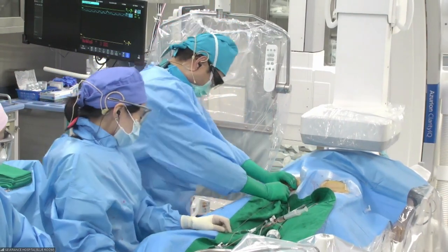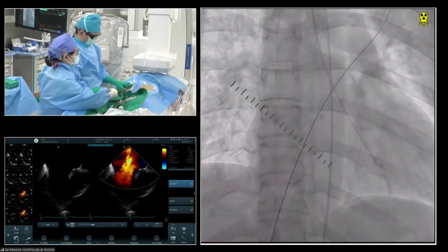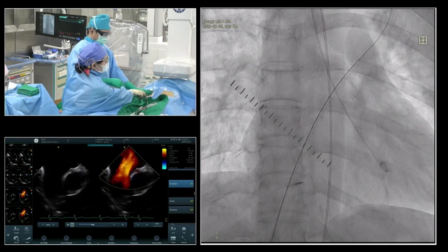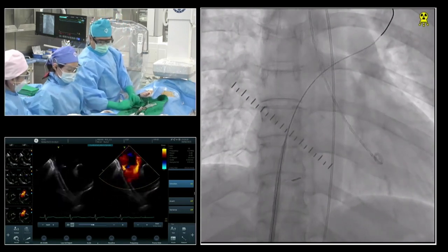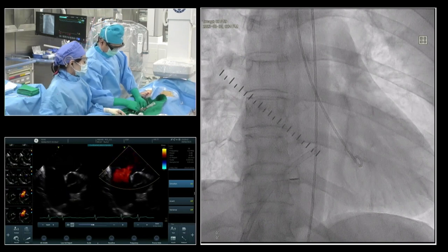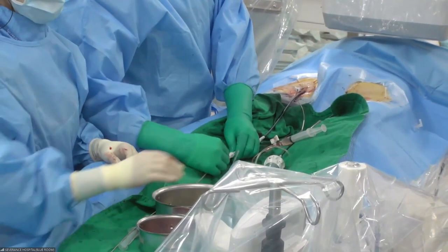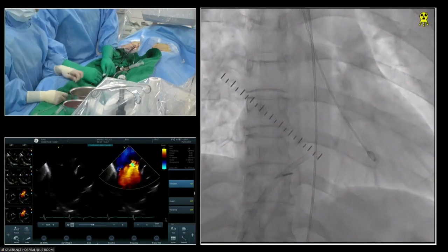Okay. So regarding the medication, I think I would recommend an SGLT2 inhibitor for this particular patient. Okay, thank you. Please text me with the accurate dosage after the session, okay? Okay. Device is ready. Okay, I'm gonna remove everything. Flush out. Can you see? Flush. Is it 11 French flushes? How many? Ten French. Ten.